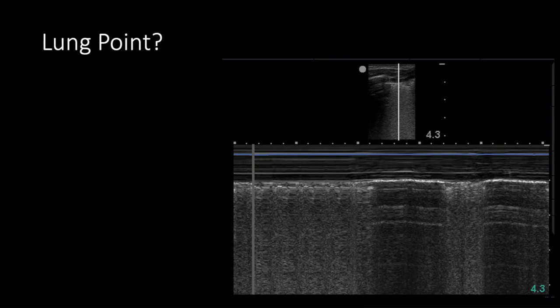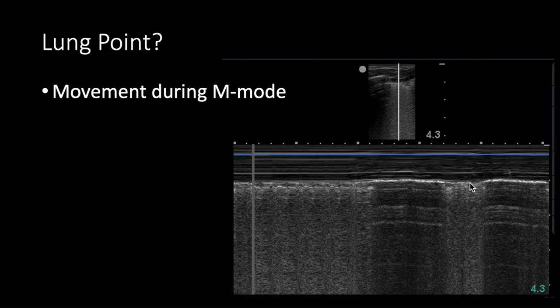Here's a question: does this M-mode look like lung point where you see granular beach, barcode, granular beach? Actually, I made this one myself — if you move the probe during M-mode, you can cause a lot of artifact and shaking. So this is actually not a lung point; it's an artifact. Keep the probe nice and still when doing M-mode to avoid false positives from probe movement.